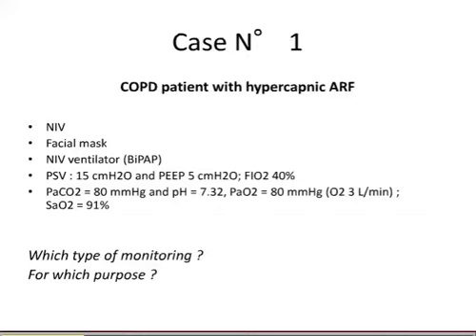PCO2 and pH. I would suggest capnography to see if he is still obstructive. Capnography? Yes. Okay. Anyone else? Pulse oximetry. He's already on it. No, it's not oximetry, that one is from the blood gas.